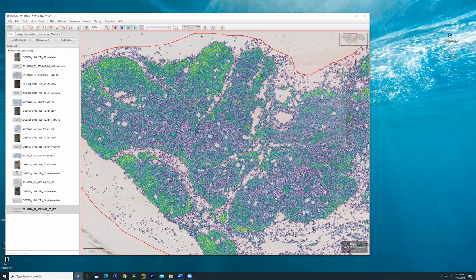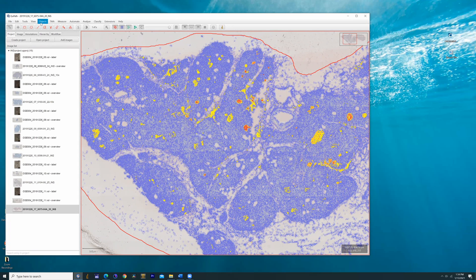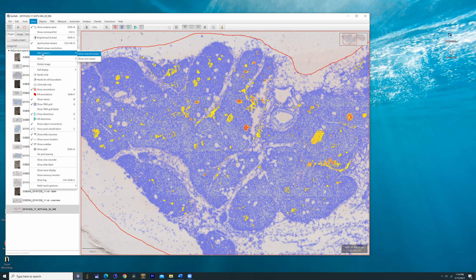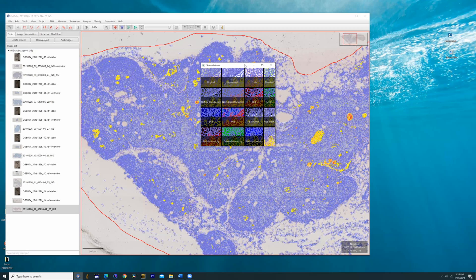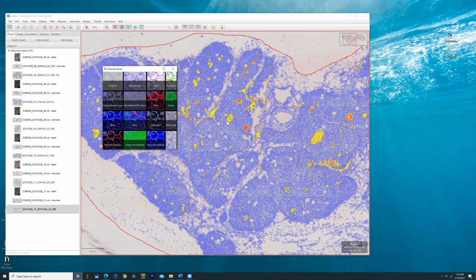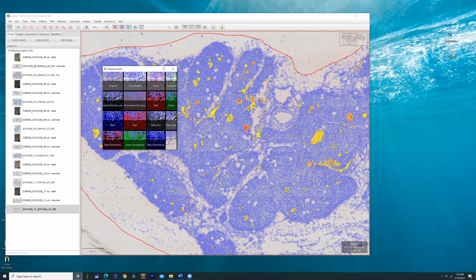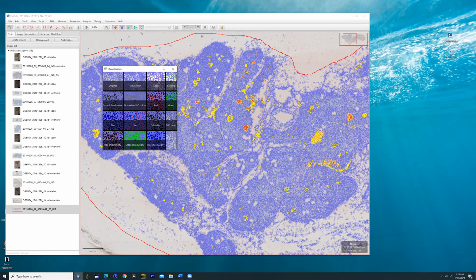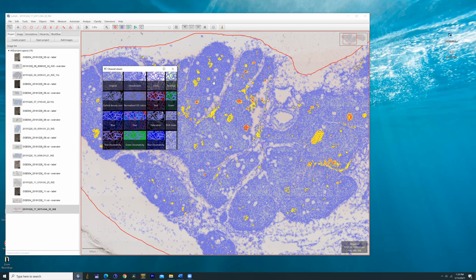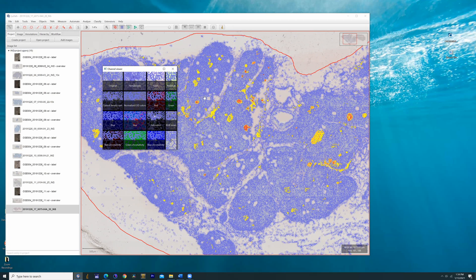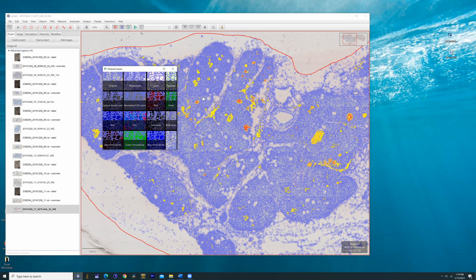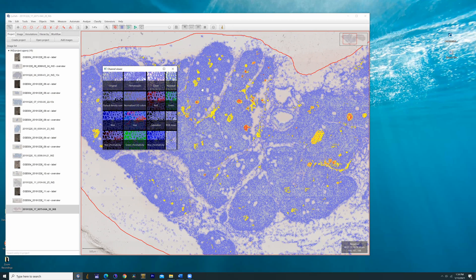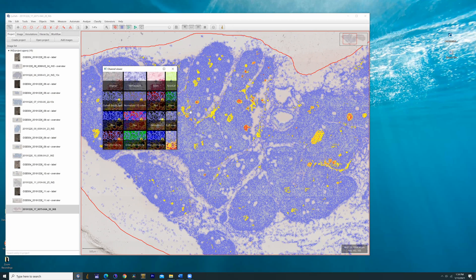A second feature beyond mapping is I noticed within this, now this goes beyond what we're doing today with immunochemical, but there's under options, you can look under view, you can click under mini viewer, show viewer channels. And so as I mentioned in the prior slides, you can actually set up, it looks like 16, I'm sorry, 15 different channels. In this case, our limitations is our gates are set on something like hematoxylin and eosin, but you can see how the potential for this, you could set up the colors for fluorescent colors like green or red or violet, blue or whatever, and then go back and look at, say, things like double staining, for example.